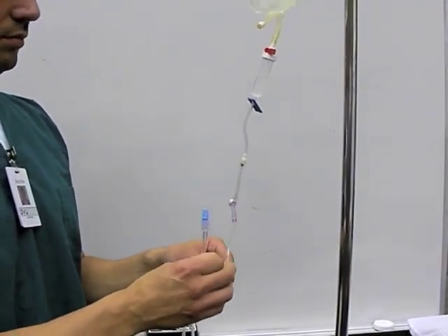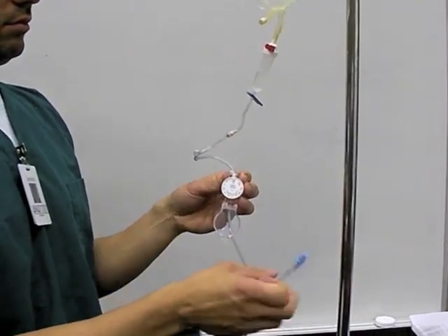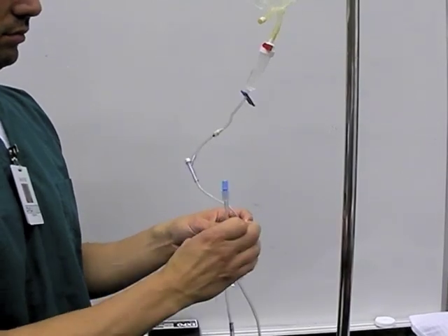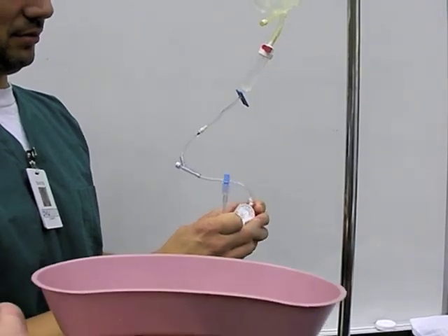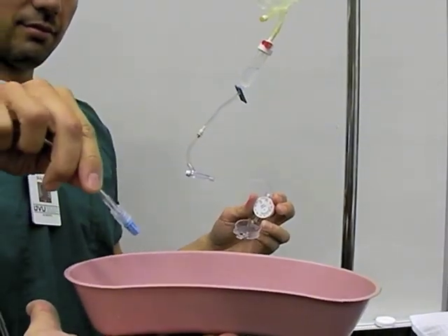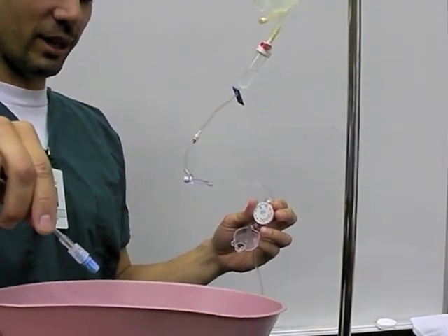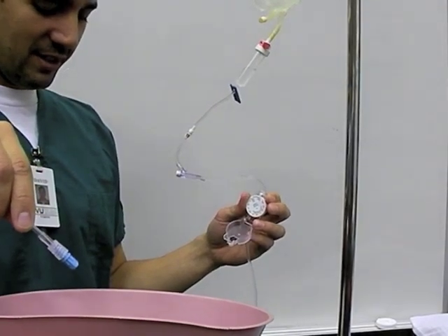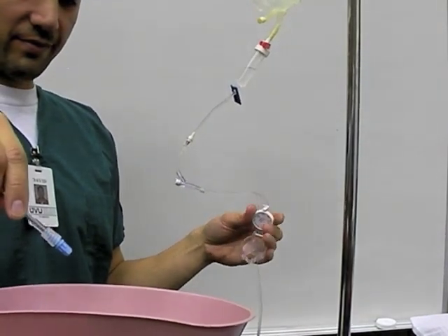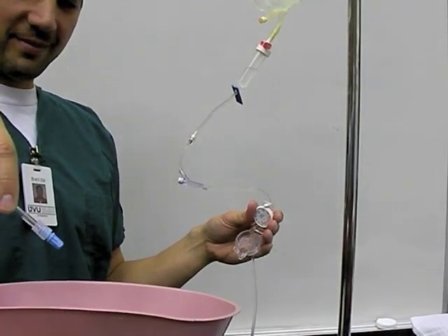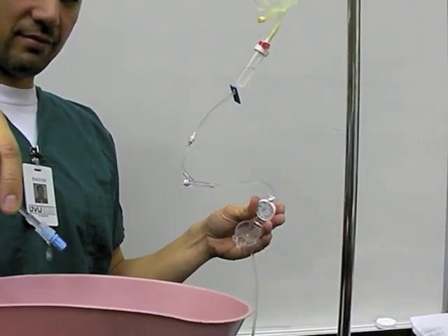The next step will be to prime the administration line. You will open the dial, which will allow the saline solution to flow through the line and purge all of the air. You will drain this into a container, trash receptacle, or an emesis basin as seen. Priming the line is done with the sterile cap still on the line. Once the line is inspected and you have determined that all air bubbles have been purged, turn the dial to the off position and close the clear cover over the dial.